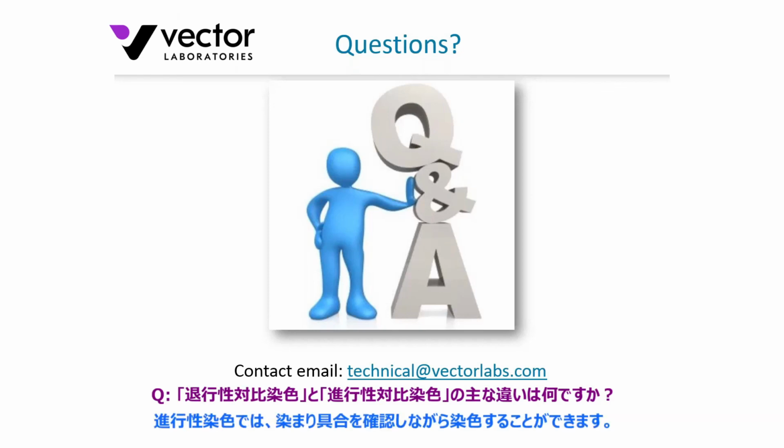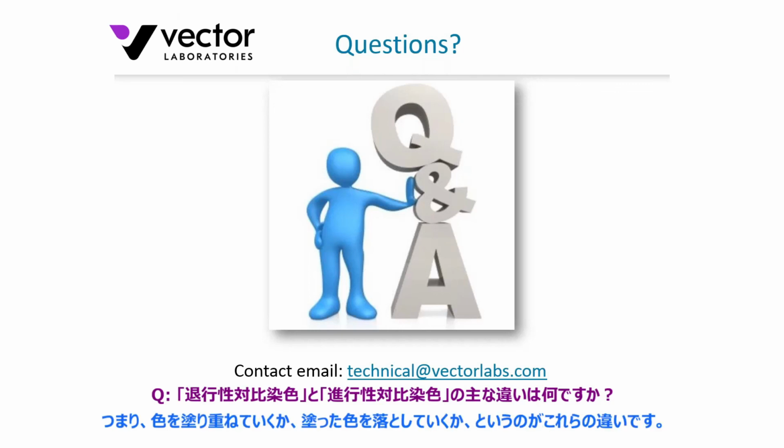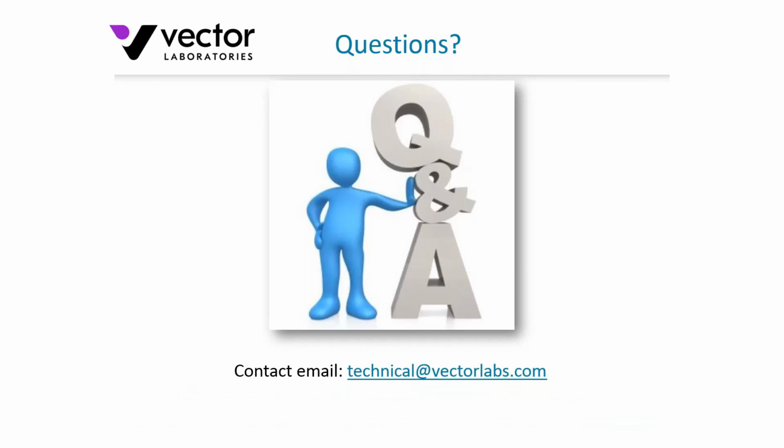So with a progressive stain, you can gauge it by leaving it in for a short period. If the staining is not intense enough, put it in again, and obviously as you move forward or progress like that with the length of time, you get a deeper, more robust or heavier stain. A regressive stain is usually something that's overstained, and then you use the differentiator to hone back or peel back the intensity to the desired contrast that you want. So painting with a broad brush, that's the key difference between progressive and regressive counterstains. All right, thank you, Craig.